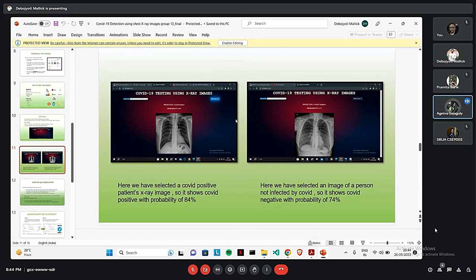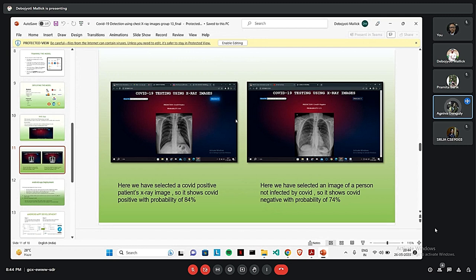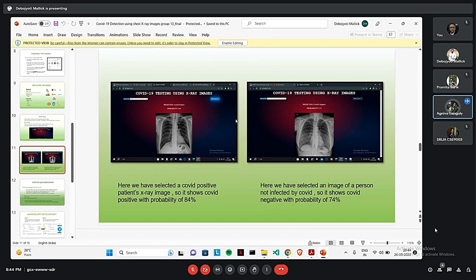Here are the two results of our selected images. On the left hand side, we have selected COVID positive X-ray image. And after predicting, this shows us that it's COVID positive and the probability is 84%. And on the right hand side, we can see that there is a COVID negative X-ray image. And it shows COVID negative probability of 74% after predicting through the whole training data. That's from my side. From now on, Sreeja will continue.